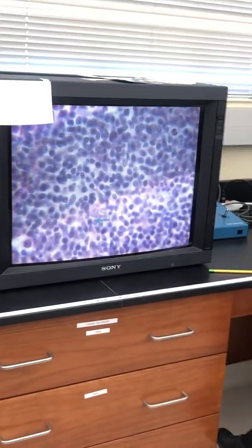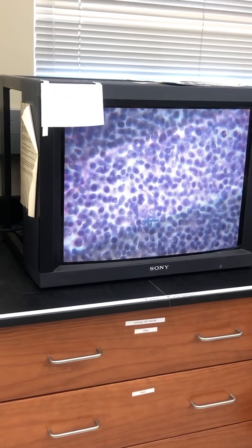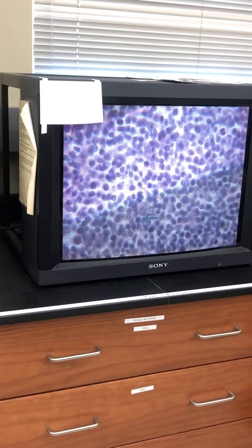Yeah. Okay. So I'm going to just scan to see if I see anything real quickly. But first, I can come back to that because it sometimes takes a long time to find that. Is there something you need to look at on your tonsils?